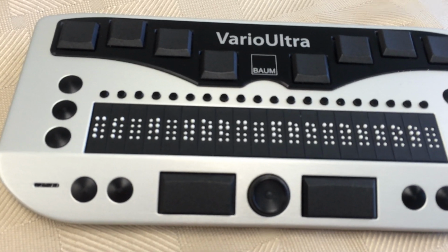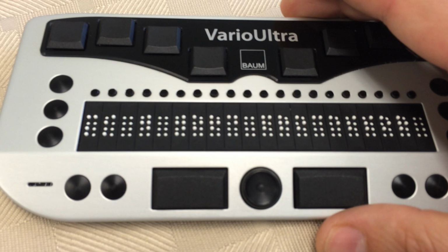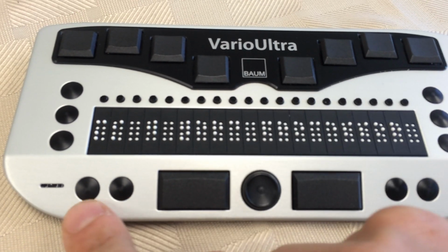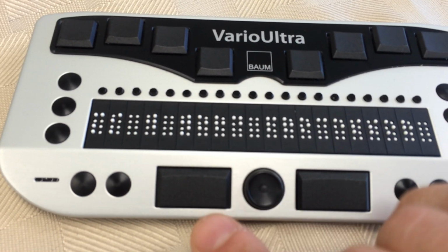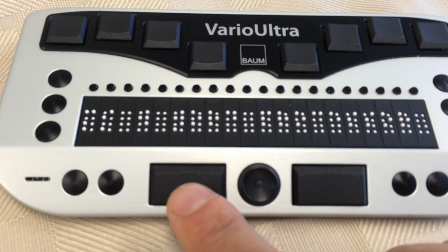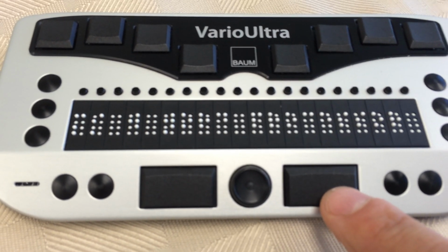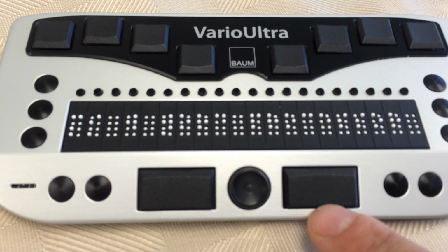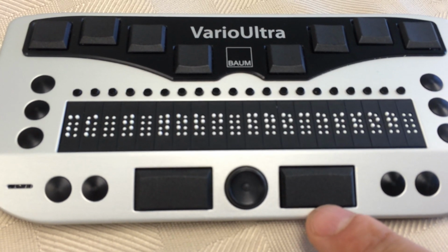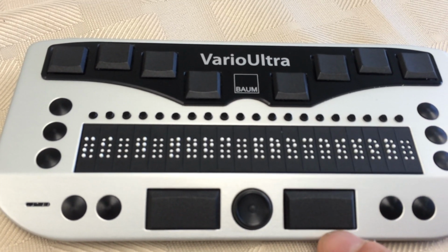Along the front side of the device, there is an angle to VarioUltra. It's very nice, by the way. In the middle of the device, there are 2 space bars: the left space bar, which is also known as B9, and the right space bar, also known as B10. They are about 1 inch in width and about 1/2 inch in height. So the same height as the Braille keys, but a little bit wider.